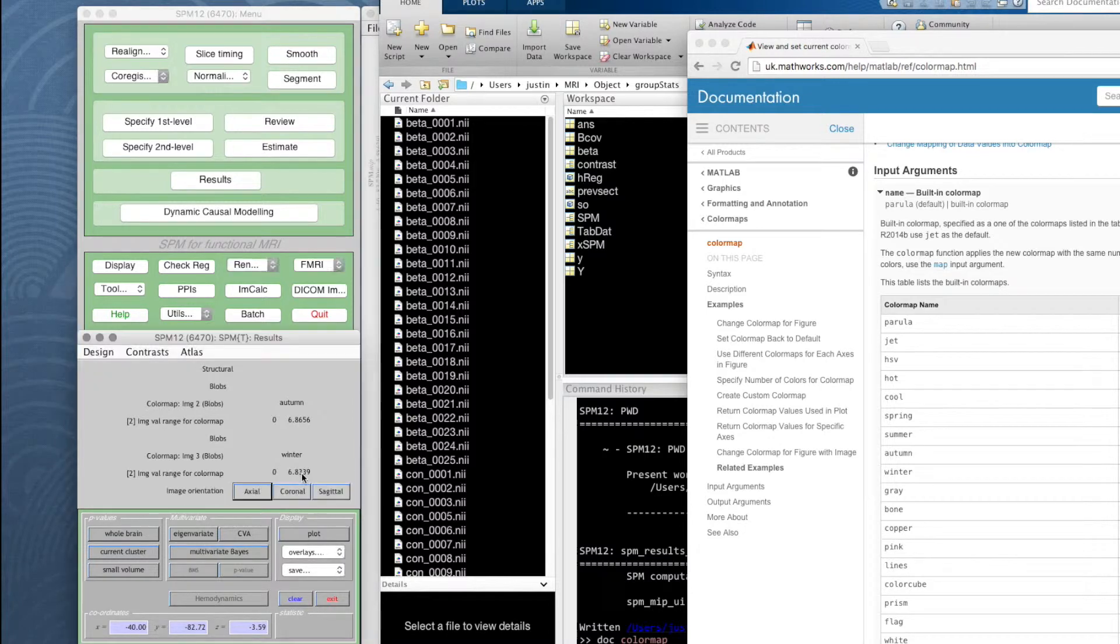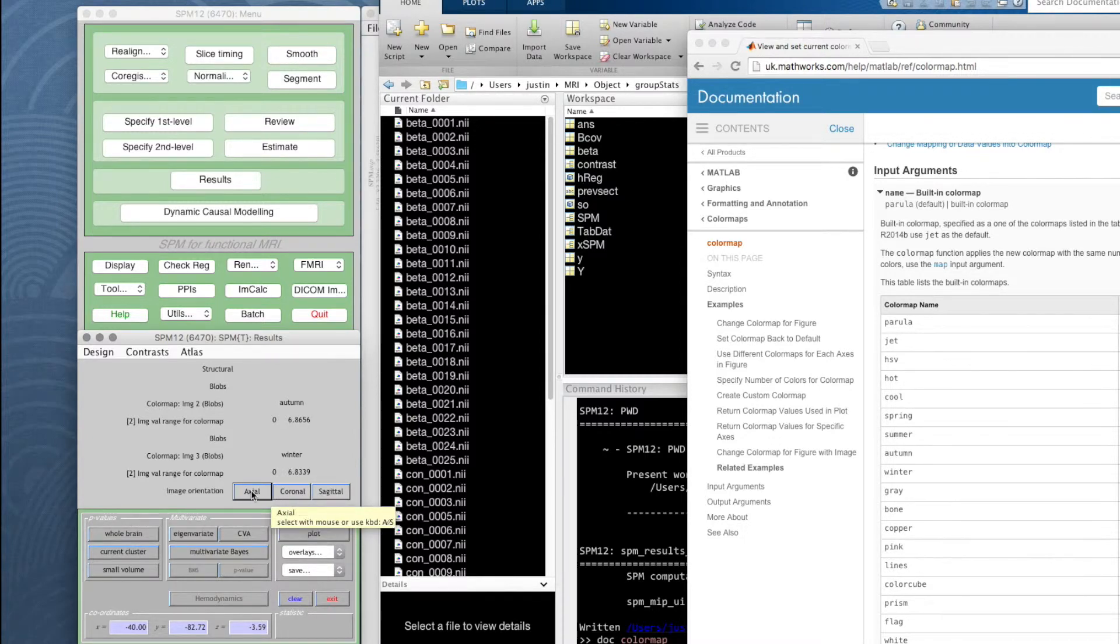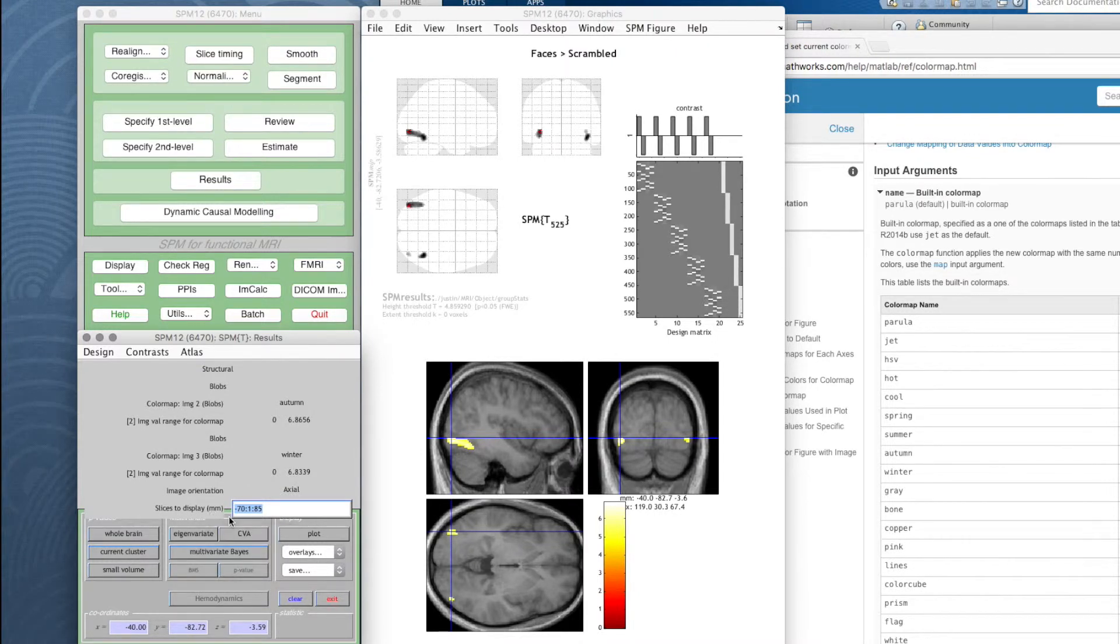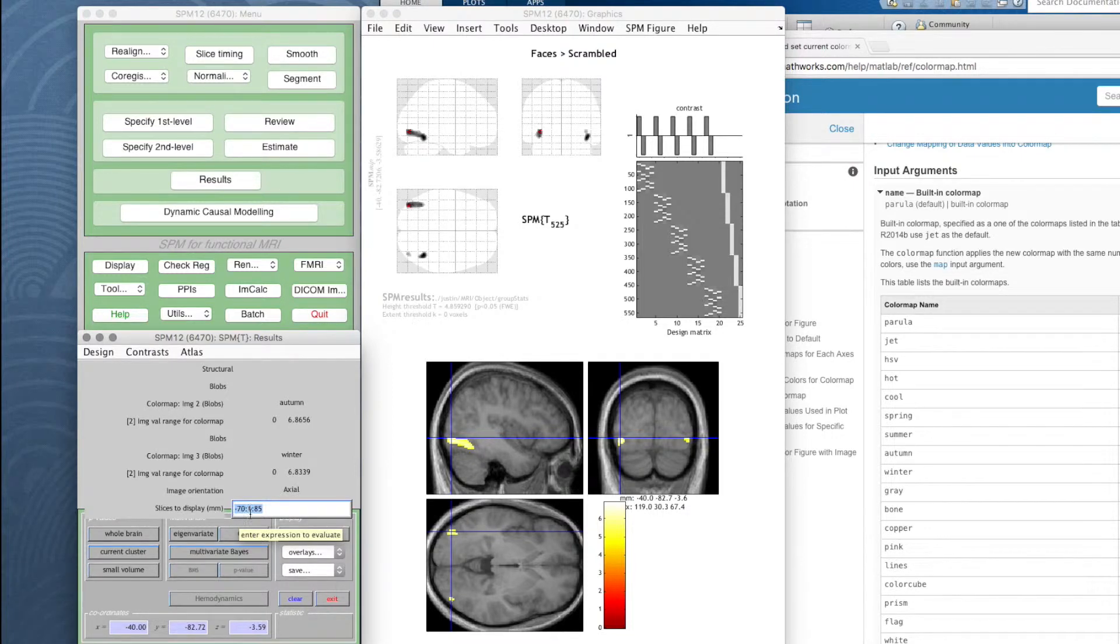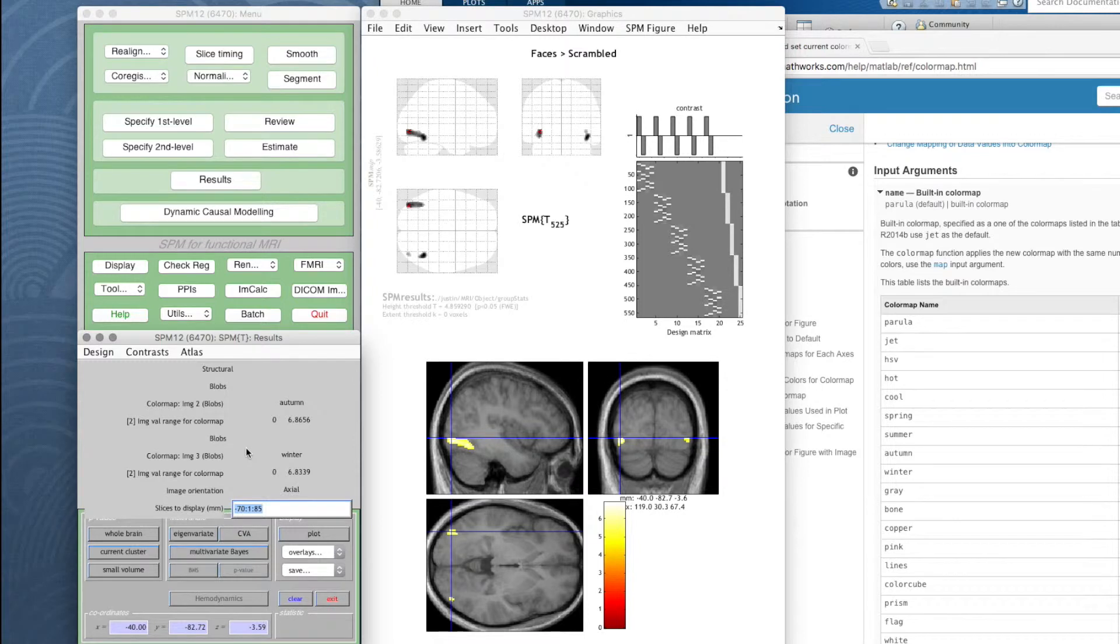It says image orientation, axial, that is transverse, coronal, or sagittal. I like transverse. And now it says slices to display in millimeters, and it's got a number, a colon, a number, and another colon. That means go from this value to this value in steps of the intermediate value. We're not going to use those. What we just looked up were the z-axis measures for the extent of our blobs.